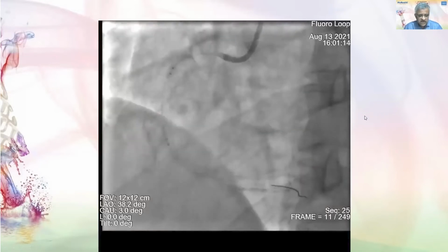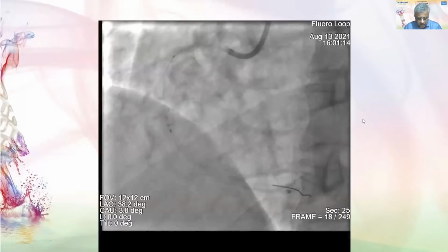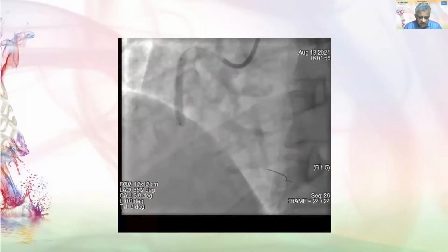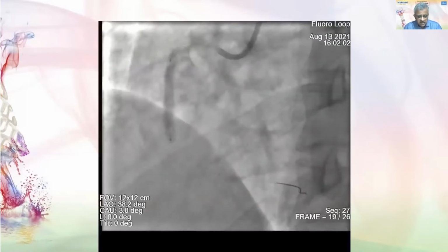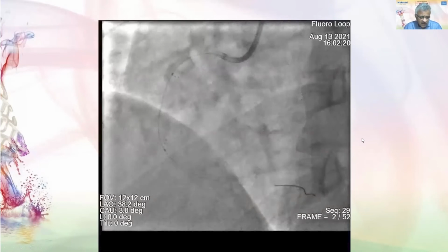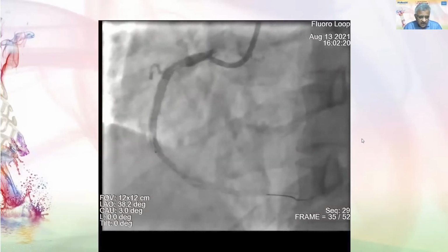After which we slowly increase to the nominal pressures and maintain at the nominal pressures. So this is the deployment of the BRS. And once the BRS has been deployed, we waited for the total time of almost 40 seconds we held on. And after that, we went ahead and took a shot.